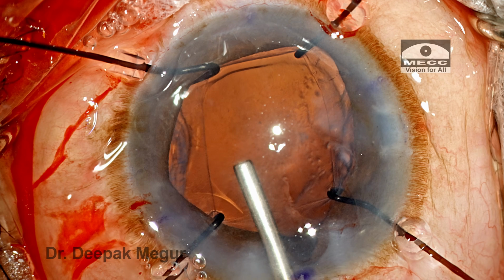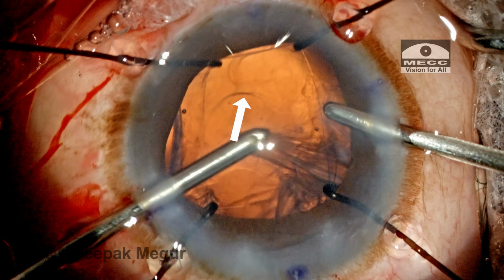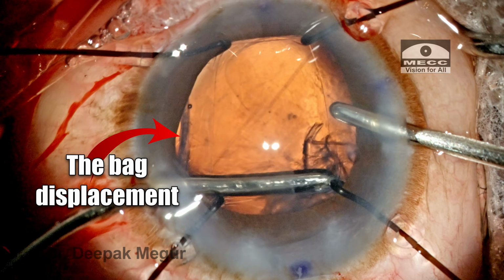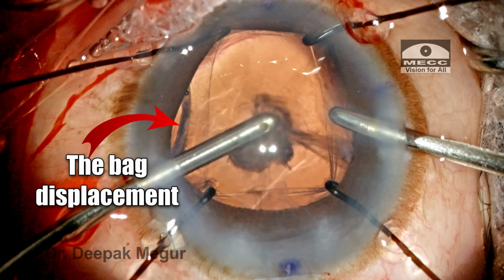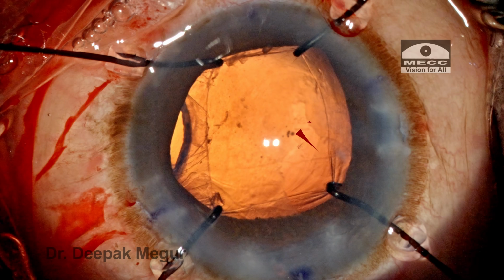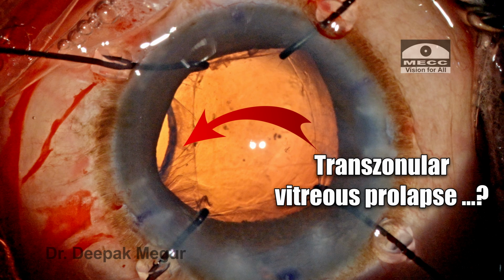Time to remove the cortex. And at this stage, the cortex is being aspirated. I suddenly see there's a posterior capsular fold here. And also, there is a displacement of the capsular bag on my left hand side. I can clearly see the edge of the capsular bag, and this is possible only if something is pushing out. And most likely, this is the vitreous, which has prolapsed transzonularly.